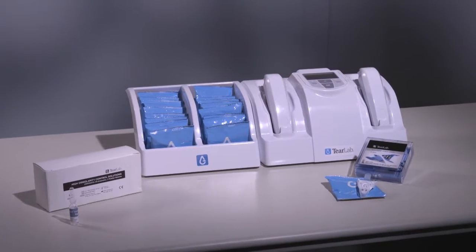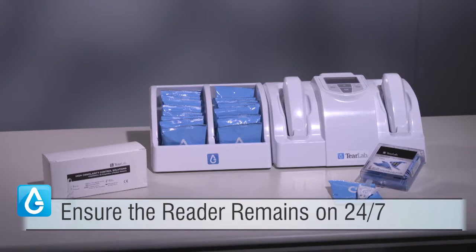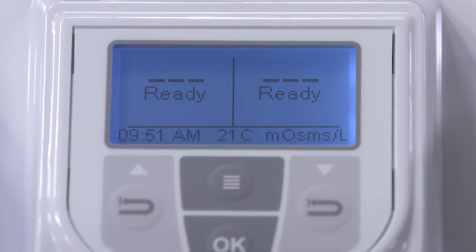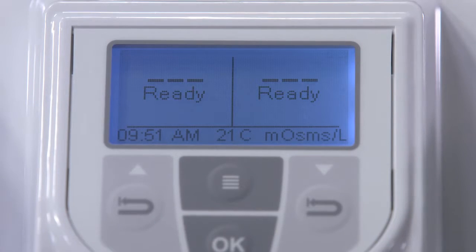As a reminder, ensure the reader remains on 24 hours, 7 days a week with the pins docked in the cradle to ensure the pin batteries are always fully charged. The battery icon must be visible on the display of the reader for the pins to be charging.